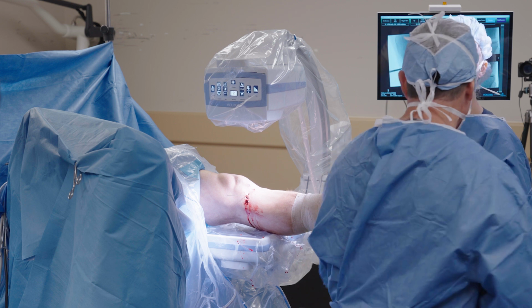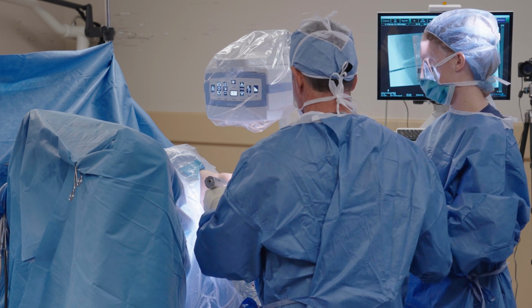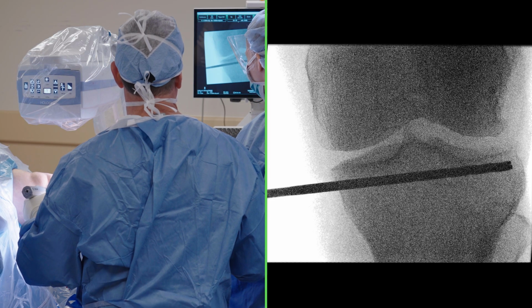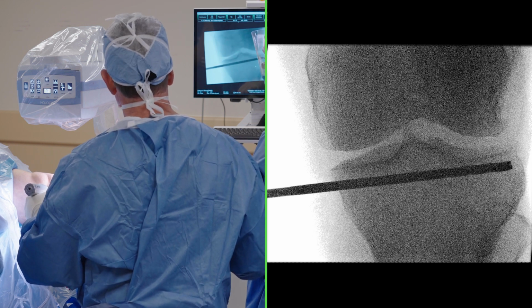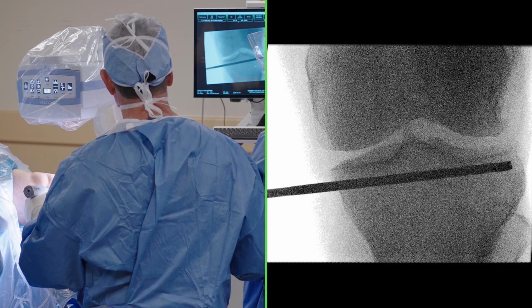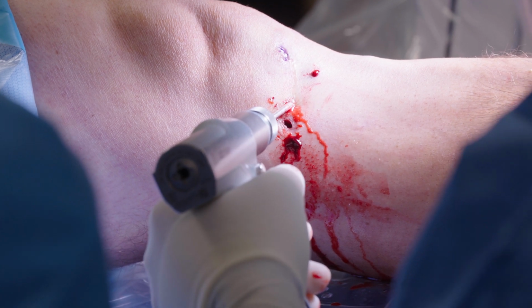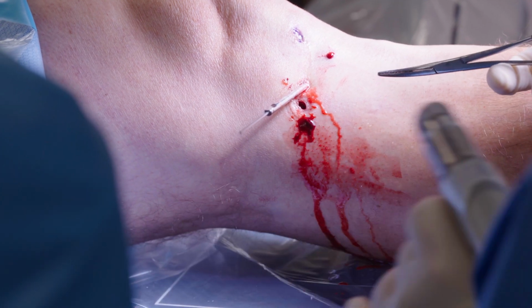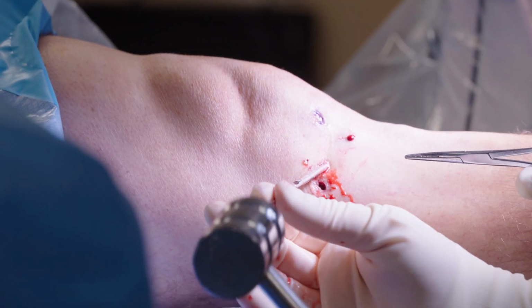Now we'll drill our second hole, and this is a way again to verify the length. So I feel myself along the far cortex. So in this instance, I know my length is pretty accurate because the tip of the drill is at the tip of the K-wire. Okay? Now, many times the K-wire will back out as the drill is coming out. The way to manage that is I'll disconnect the drill from the K-wire. I'll use a mallet to impact the K-wire. And then I'll finish removing the drill.